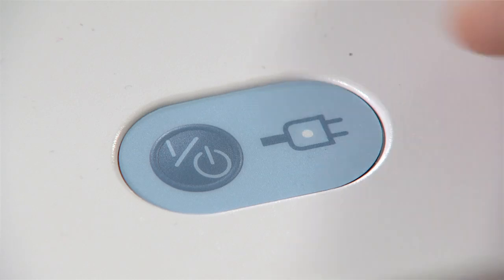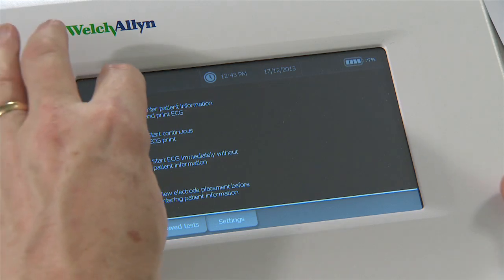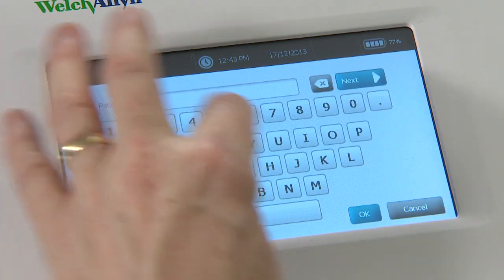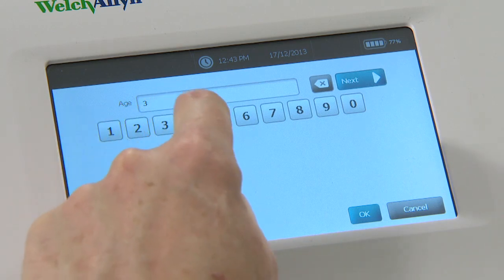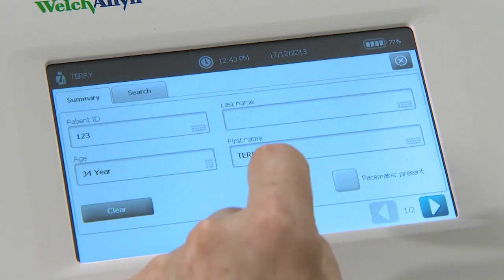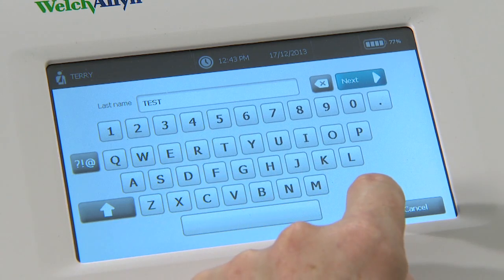When you've prepared your patient, taking a 10-second auto ECG is really simple. Simply switch the unit on and using the touch screen select 'Enter Patient Information'. Then put your patient details in — the NHS or ID number, their age and their full name — and press OK.